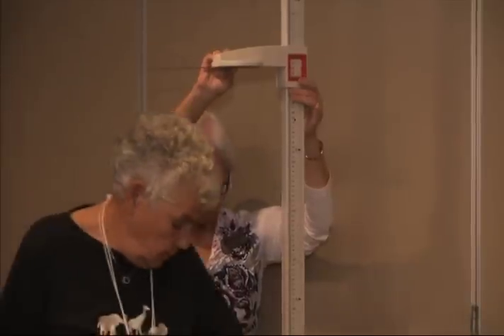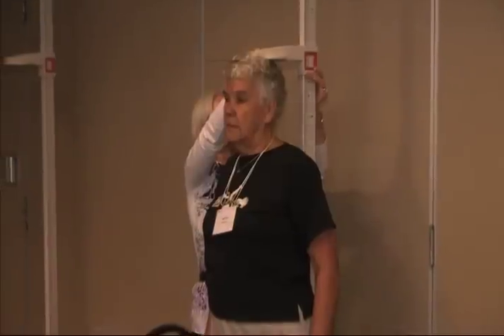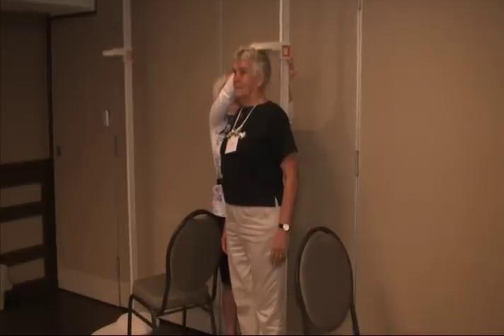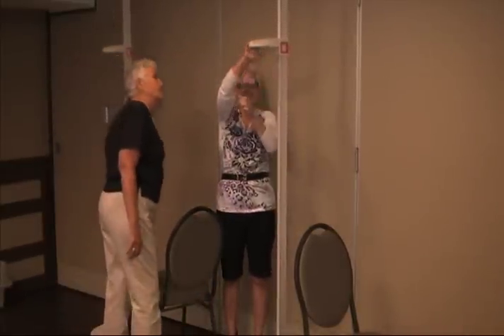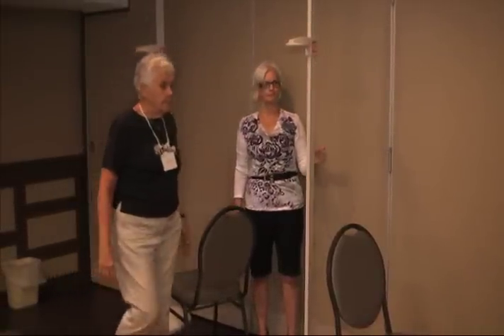Let's do a second one. Looking straight ahead — are we touching but not crushing? I've got five foot six and three-eighths this time. We had a quarter last time, so we're an eighth of an inch taller now. Show me how tall you can be, Judy — you've got that imaginary load and your muscles will know what to do as you think tall. And she just came up to five foot six and five-eighths. Step away and have a look at the reading. Five foot six and five-eighths confirmed.